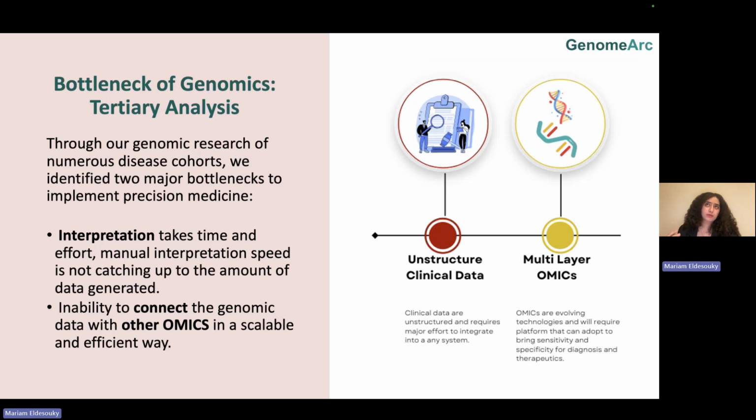And so we arrive at the bottleneck of genomics. So right now, sequencing is streamlined, primary analysis is streamlined, secondary analysis is streamlined. But then when you come to tertiary analysis and you want to determine the impact of variants, whole genome sequencing provides how many variants? 5 million on average. So you want to determine which of these 5 million, maybe 10 or 20, might be impacting the phenotype or disease. So you have a complexity in the interpretation of the variants.